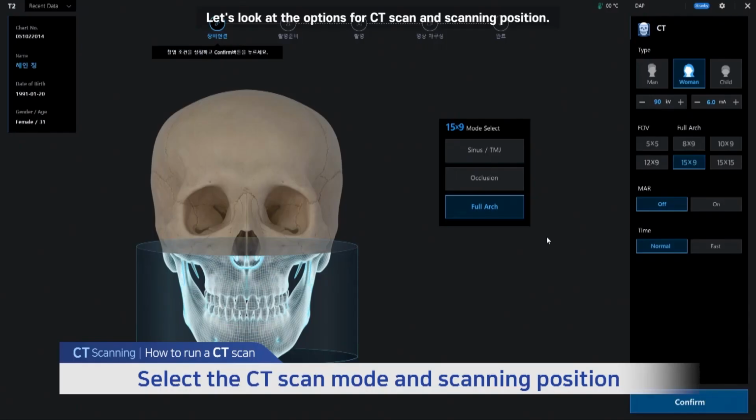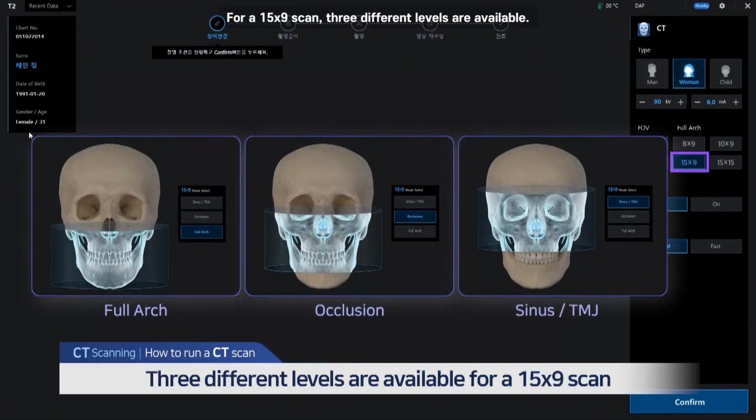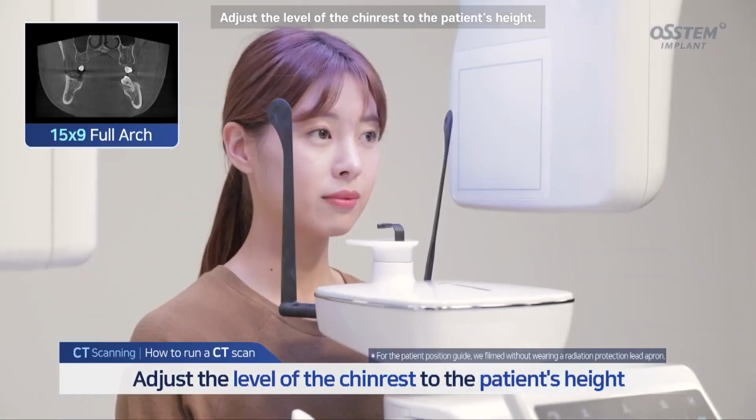Let's look at the options for CT scan and scanning position. For a 15x9 scan, 3 different levels are available. Full arch scan covers from the lower chin to the inferior border of the maxillary sinus. Adjust the level of the chin rest to the patient's height.